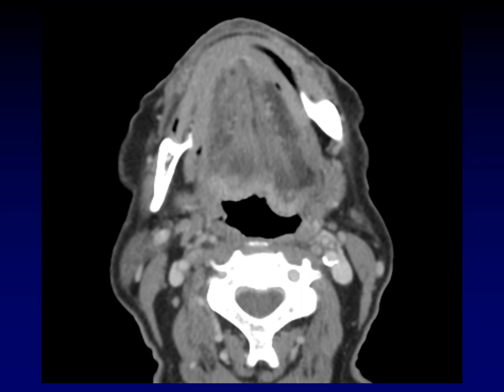Okay, hopefully you've formed your own opinion. Now let me show you what I'm seeing here. This looks like a mass of the tongue base at first glance, but there's no depth to the enhancing tissue, and there's no invasion of the underlying layers of muscle and fat that we would normally see in an aggressive lesion in this location.